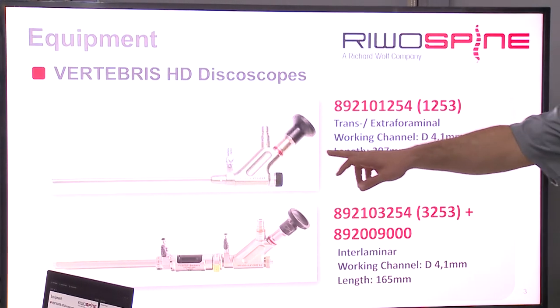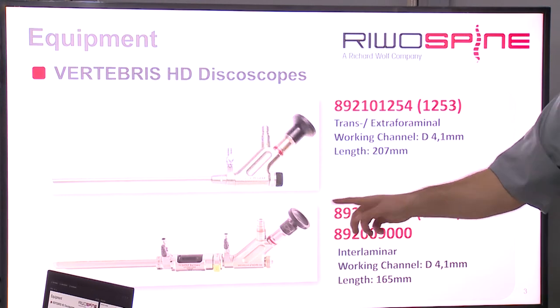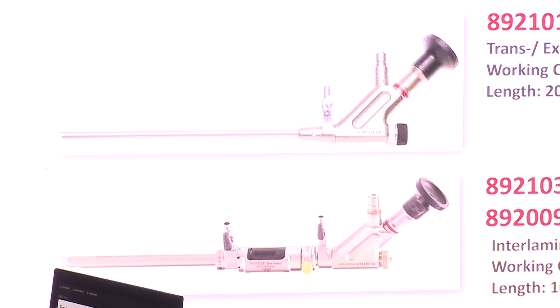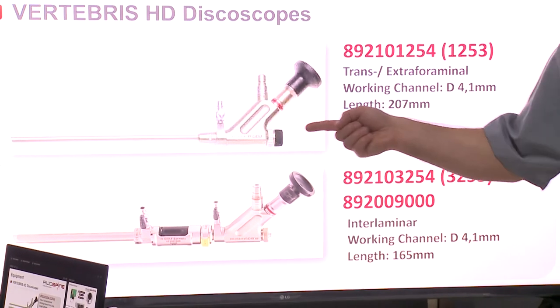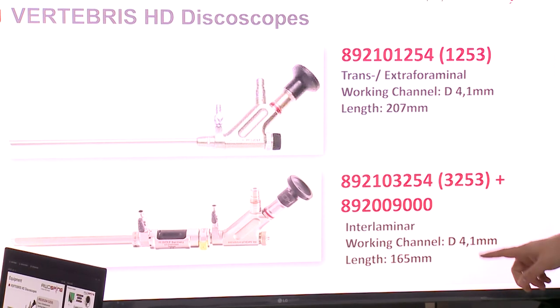One of them is the longer one. We use it for the transforaminal approach. The other one is the shorter one. As you see in the operation, we use it for the interlaminar approach. But the working channel of both of them, the instrument channel, is 4.1 millimeter. The maximum diameter of instruments you can use inside this is 4 millimeter.